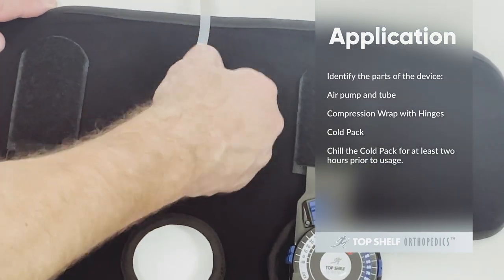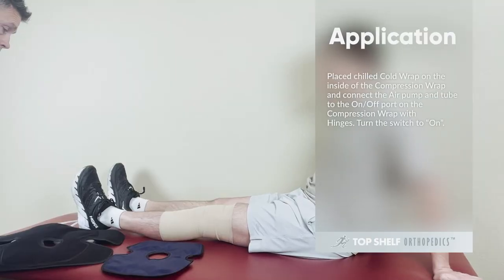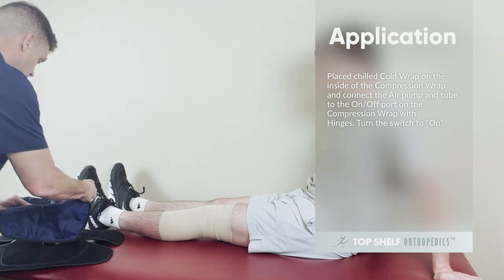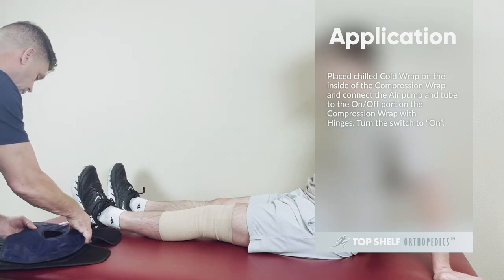Chill the cold pack for at least two hours prior to usage. Place the chilled cold pack on the inside of the compression wrap and connect the air pump and tube to the on-off port on the compression wrap with hinges.